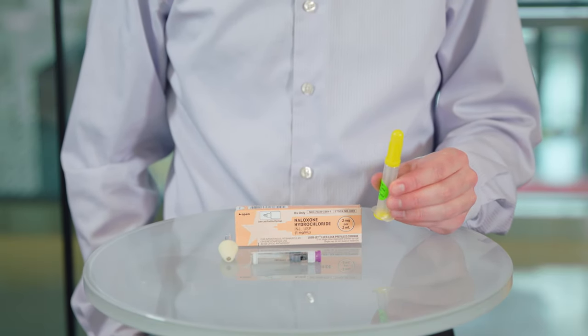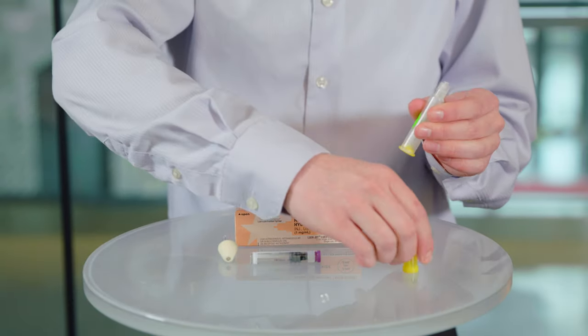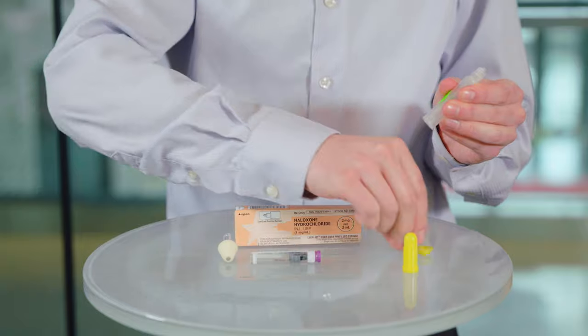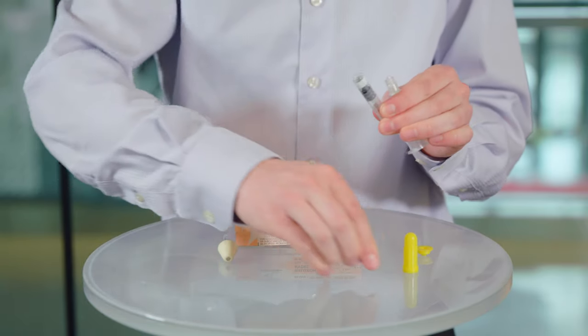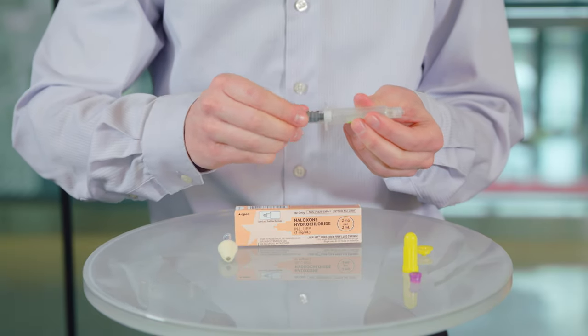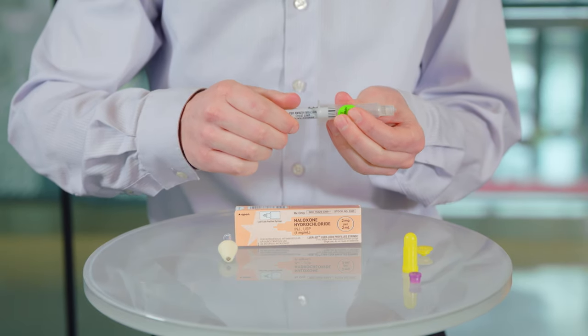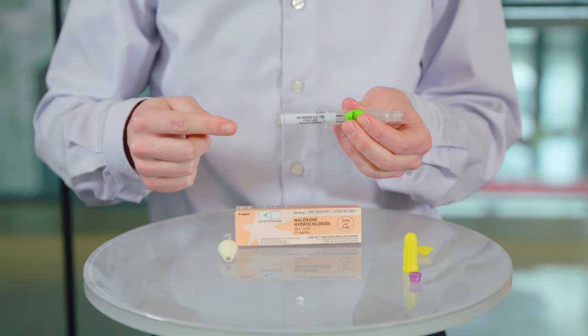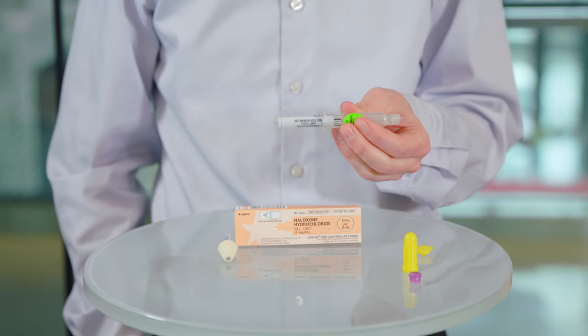First, remove all of the colored caps. There are two yellow caps on the syringe and one purple cap on the medication vial. Then twist the medication vial into the syringe until you meet resistance. Be careful not to press on the bottom of the vial while assembling, as this will cause medication to drip out of the syringe.